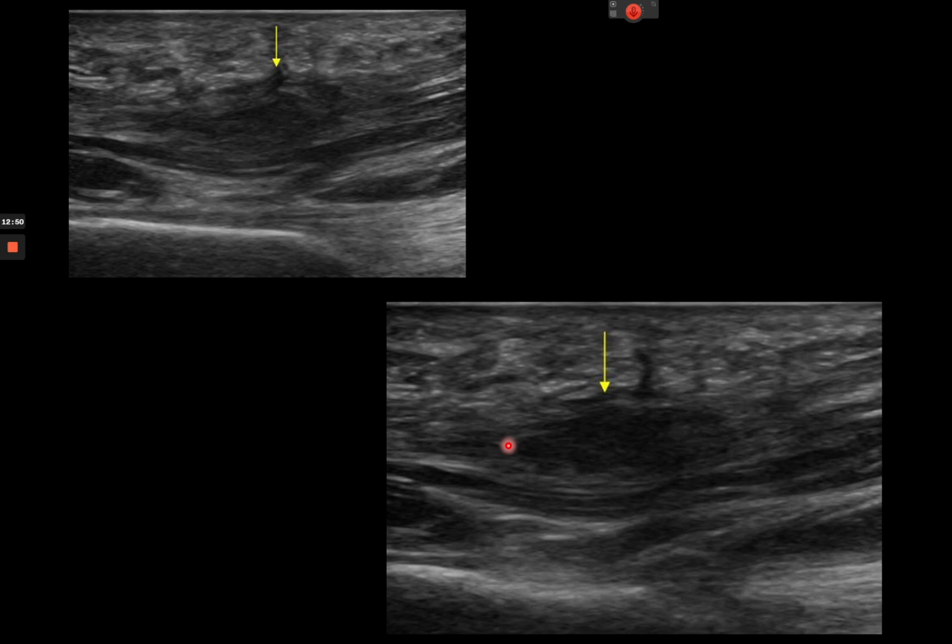Really, it depends on the patient. But when they're really delaminated like that, they don't tend to respond well to shockwave. That's why knowing how bad it is in terms of being able to visualize that can be really helpful, because when I see it like that, I change the expectation with the patient.